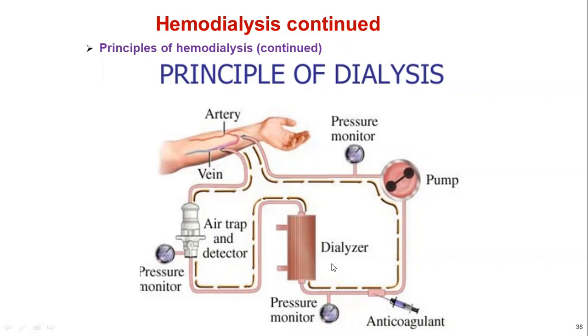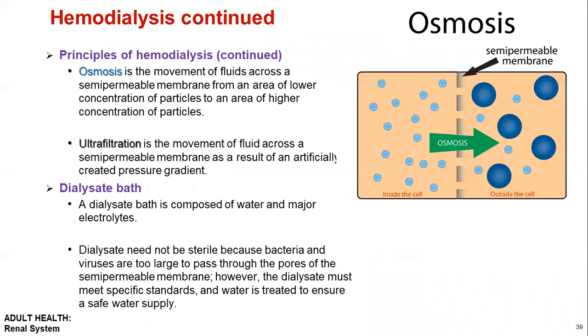And also it communicates with the fluid on the outside. During this process, we can add some medication like an anticoagulant, which prevents any unwanted clotting.